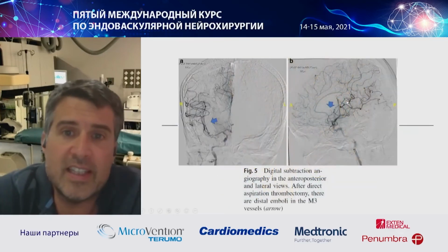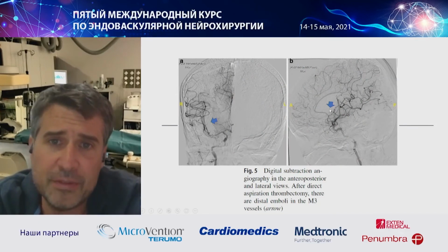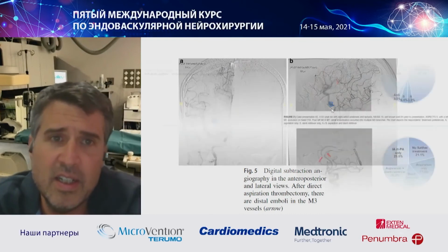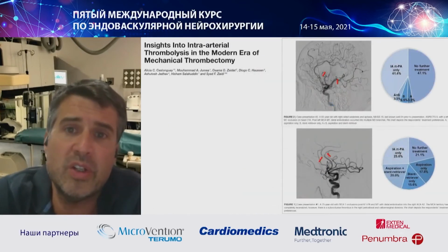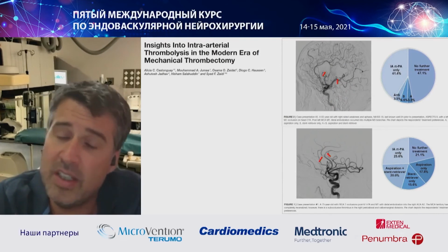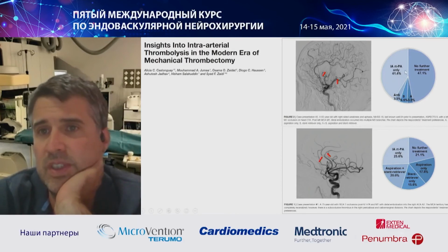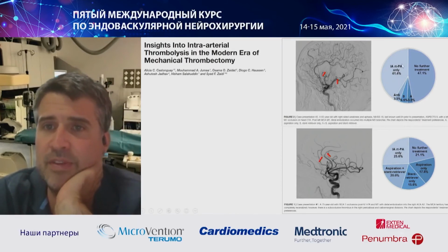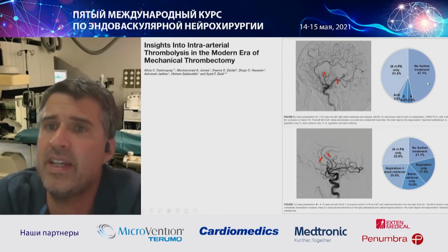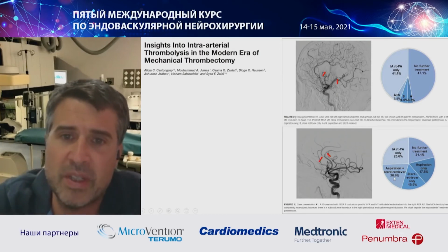What should we do in cases like this? Another option, when you find yourself after an initial thrombectomy with distal thrombi: should we use intraarterial lytics? Again, this is another survey in which there were multiple opinions from multiple operators. Many of them thought it's interesting to give intraarterial TPA, others didn't, or even do more mechanical thrombectomy in these cases.